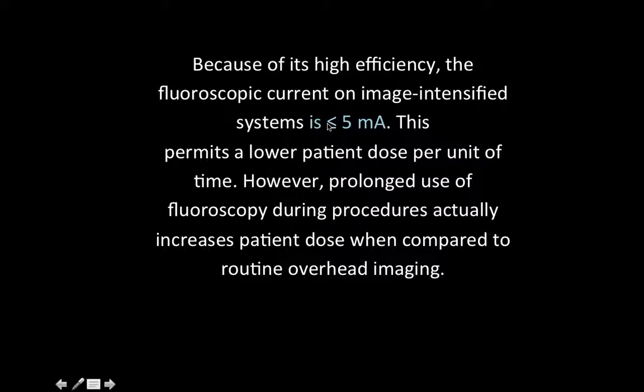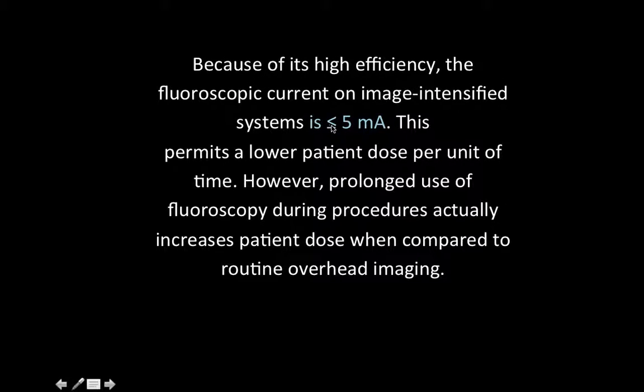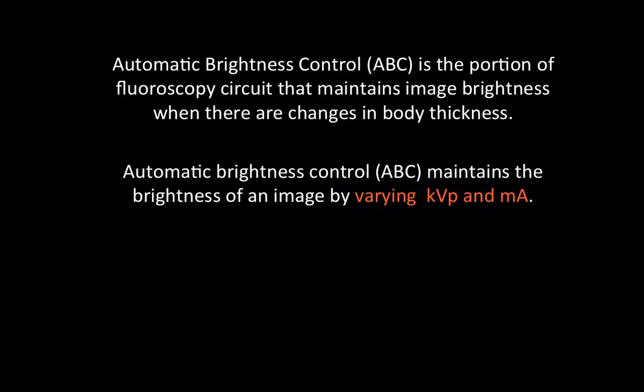And this less than or equal to 5 mA should be in red, just in case you guys needed to know that, which you do.